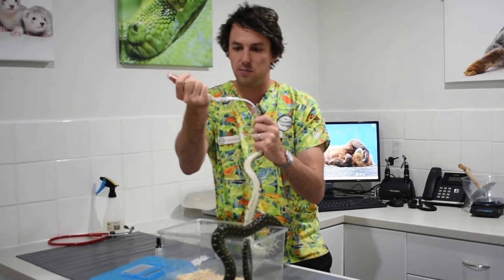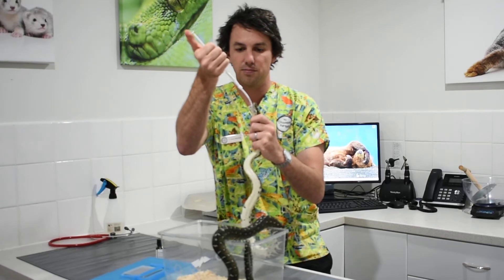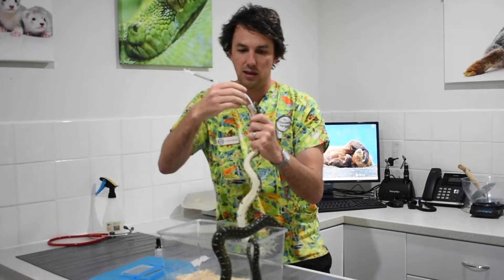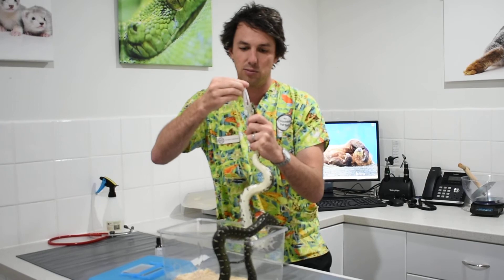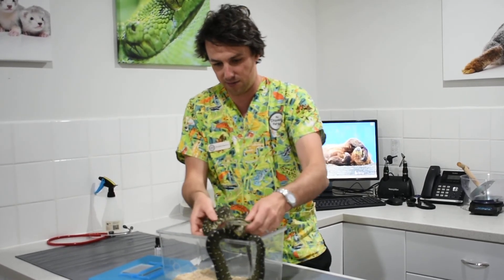I'll just do that one more time — and you can also use water for this as well if you prefer. There we go, great. And then as you're coming out, you just want to kink that tube and pull that out gently, and you're all done. All right Noodle, you did very well.